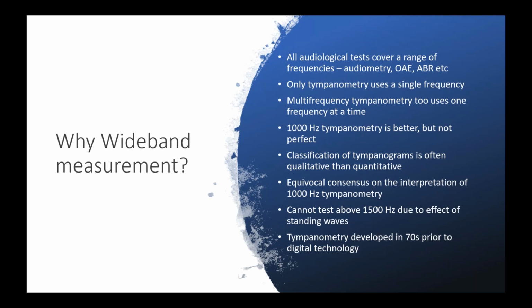Can we go above 1000 hertz? We can, but because of the effect of standing waves, we cannot go for tympanometric measurements above 1500 hertz. And lastly, tympanometry was developed in the 70s before the digital technology. And we still are maintaining the same classifications. And I think it's time that we challenge ourselves and our practice.